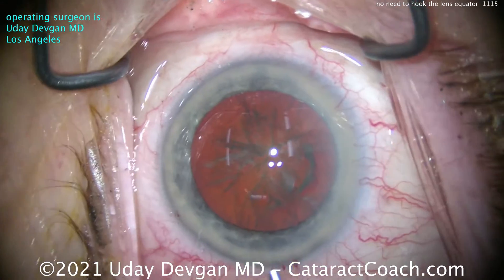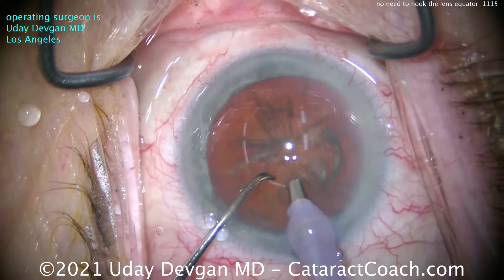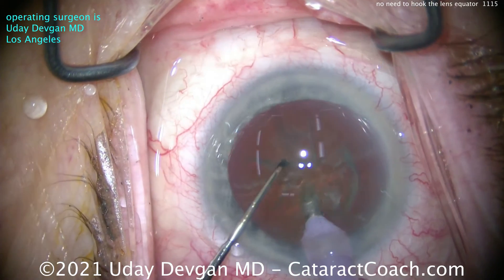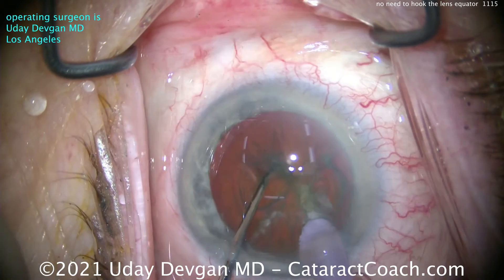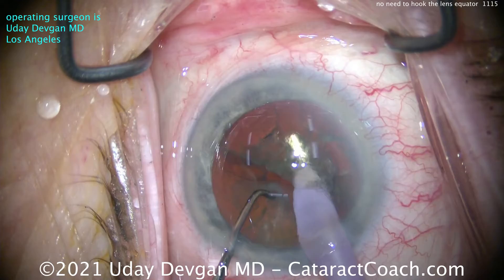Let's watch it first in real time and then in high magnification and slow motion. Place the chopper into the nucleus — watch carefully — not under the rhexis, within the rhexis. Bring the instruments together and apart.